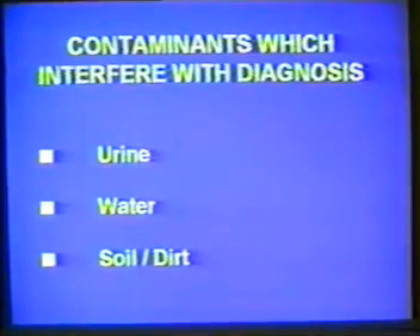Collection of faeces directly into the container is preferred. Contamination of the sample with water, urine, dirt, or soil should be avoided. Urine and water destroy protozoan parasites. Water may also contain free-living organisms. Soil and dirt may introduce free-living organisms, especially extraneous helminth forms that may complicate diagnosis. Faeces should never be collected directly from toilet bowls, nor from soil or grass.